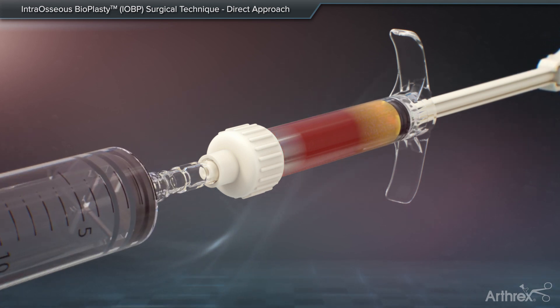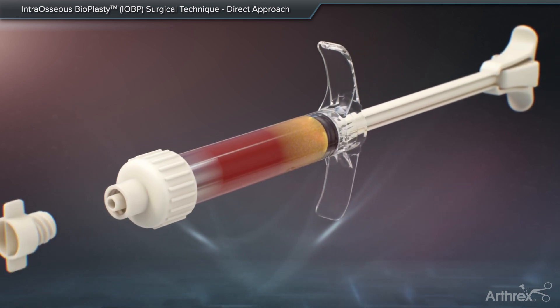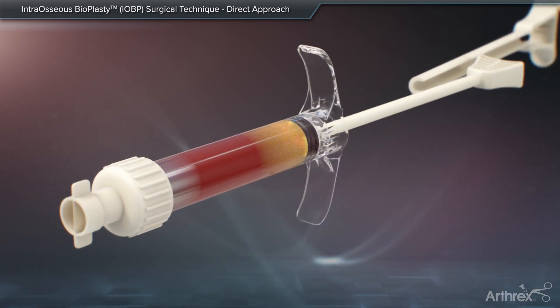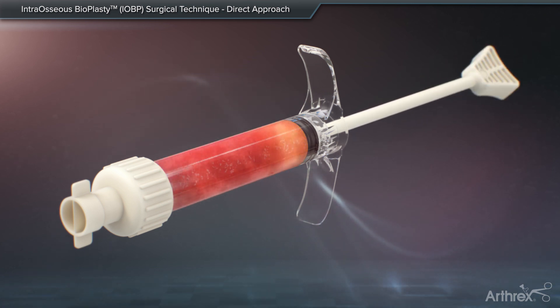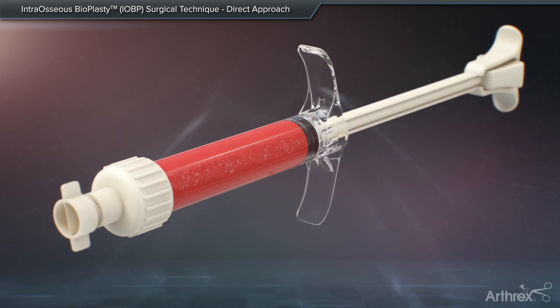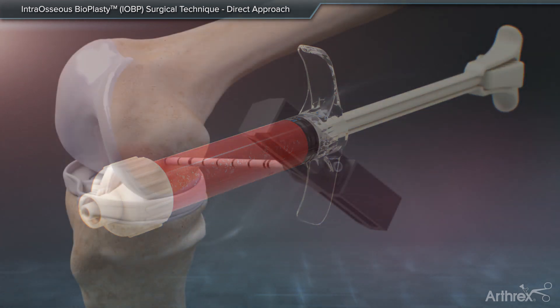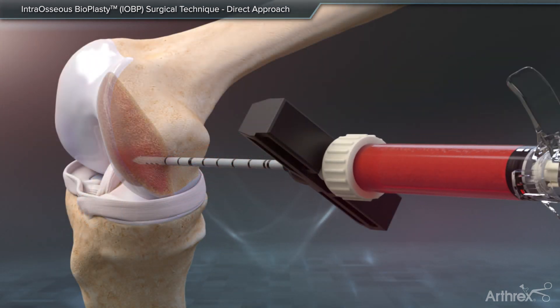The female-to-female luer adapter is removed and the luer cap is secured to the mixing syringe. Unsnap the push rod from the mixing element. Push and pull the mixing element back and forth until thoroughly mixed. Pull back on the mixing element and snap the push rod back onto the mixing element. The mixing and delivery syringe is then assembled with the delivery cannula.